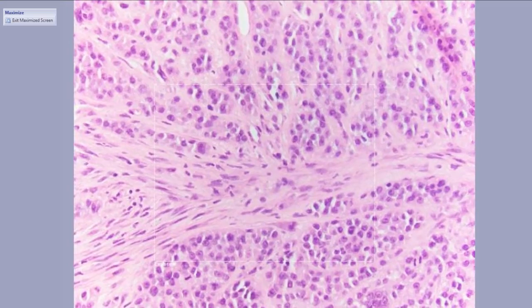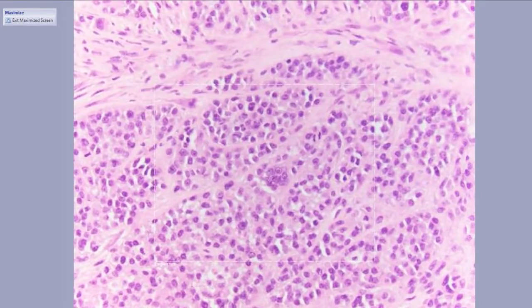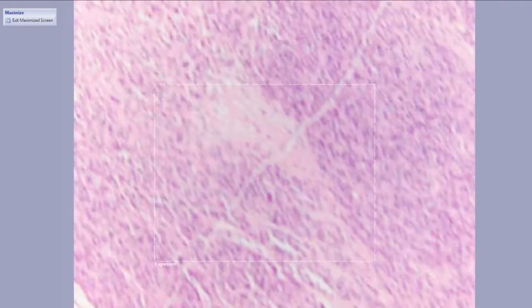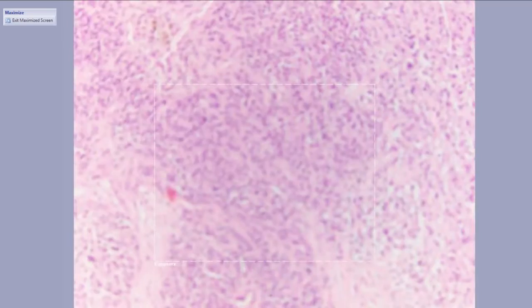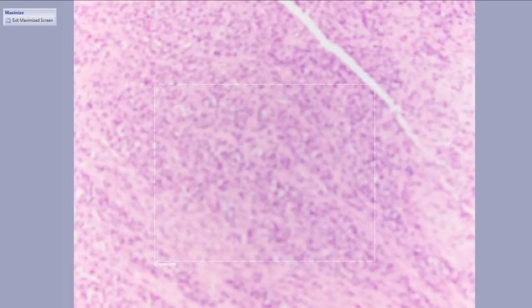It's just barely on the field. Let me move it here. There you can see more toward the center now. We have occasional giant cells or clumps of cells. This is also pretty malignant looking. There's little areas of maybe cell death or necrosis. Doesn't look like much of what we've seen before, though of course you're going to have to throw a whole lot of stains on it.